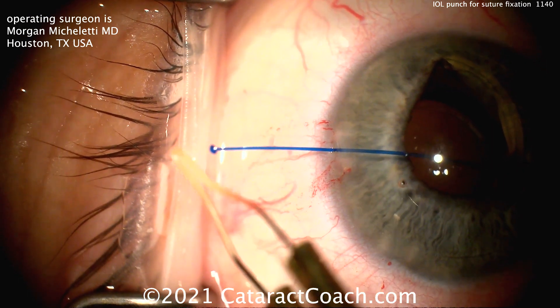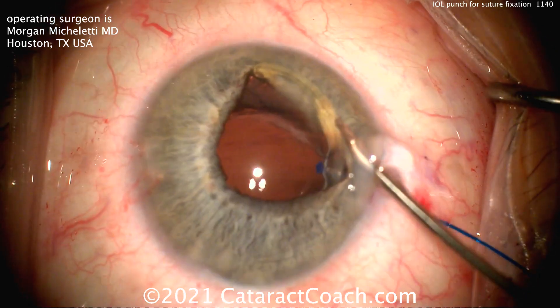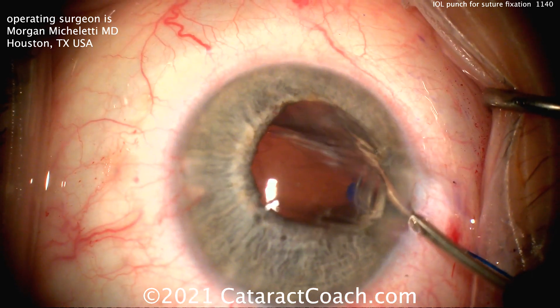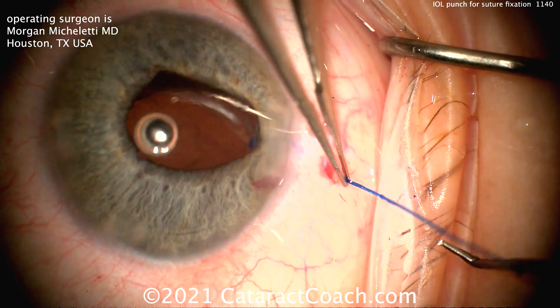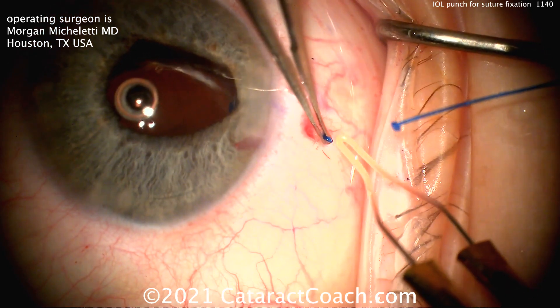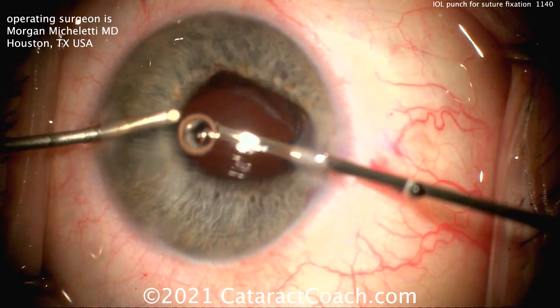You can use cautery to melt the end and create a little stop — this is very similar to the Yamane technique. Then we bring the whole IOL back down into position and adjust the final centration. This patient has a multifocal lens, so you pull on the suture to create the final resting position, then a little cautery on the other end creates a bulbous tip that can be placed in the eye.